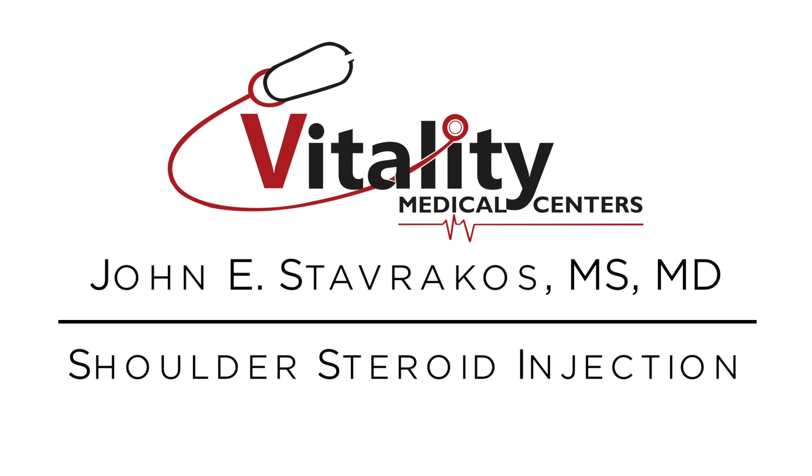This short segment is going to talk to you about the procedure for doing an ultrasound-guided steroid injection in the shoulder. Most of these injections are done very simply over the side of the shoulder. We call this the subacromial injection.